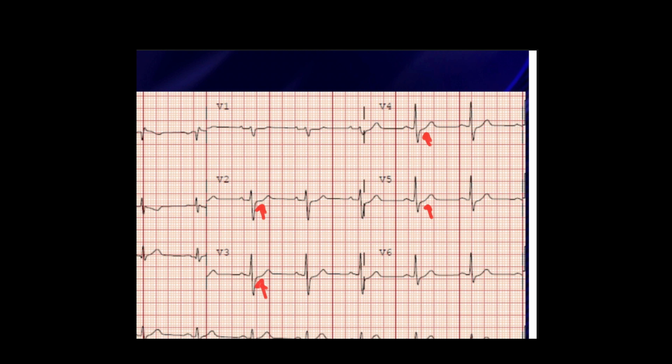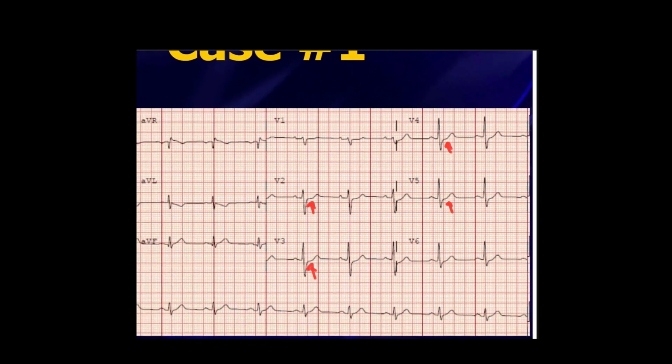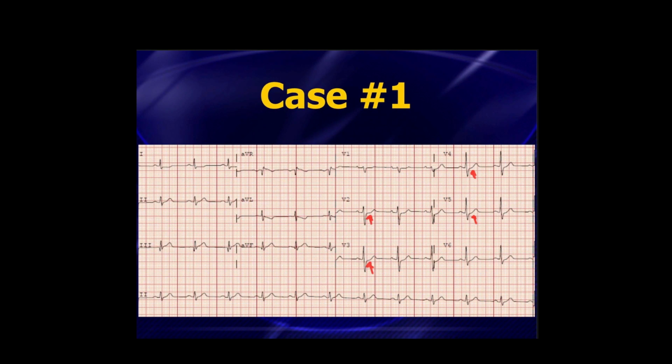We've talked about this before. The ECG machine will not call something positive unless it's at least a full millimeter. But the other reason it's going to call it non-specific is because of that ST segment downsloping in lead AVL, and maybe just a little bit of ST segment sagging in lead 1. Hopefully many of you have picked up on this. We alluded briefly to this last week.